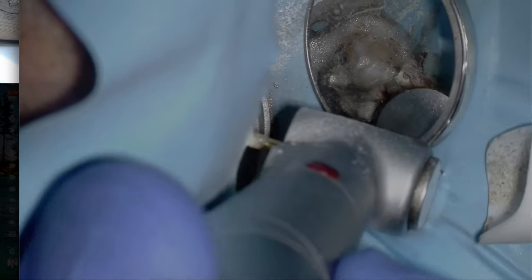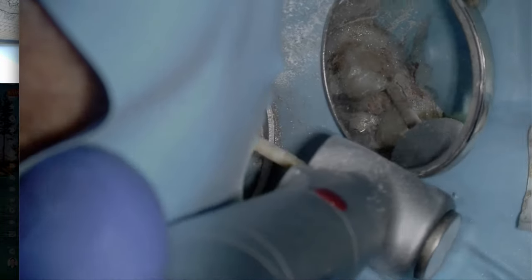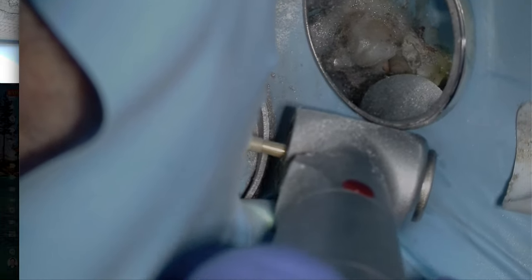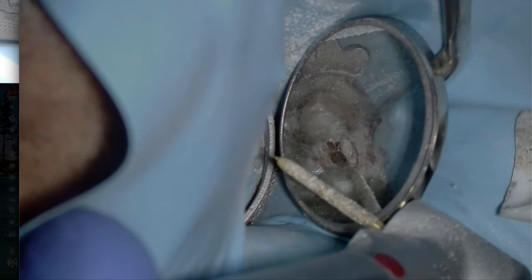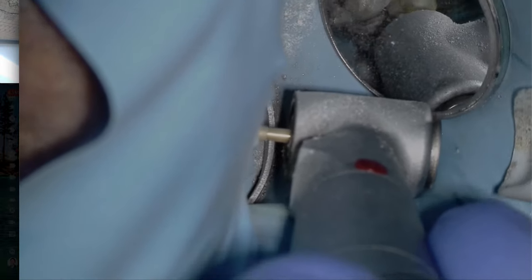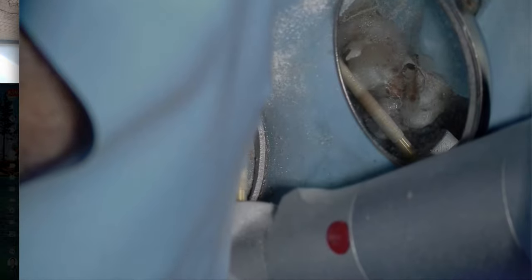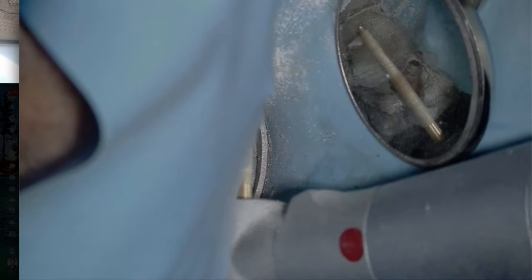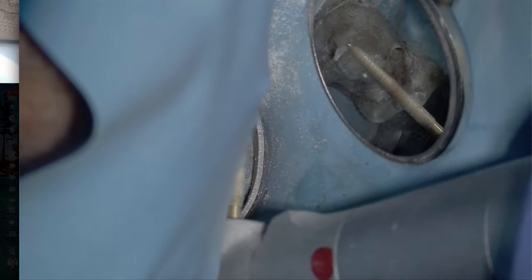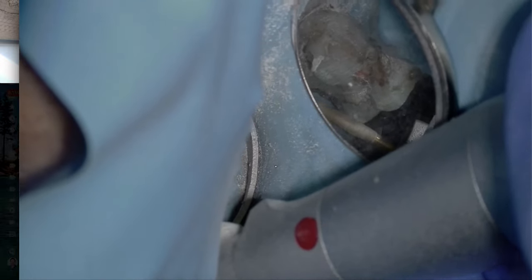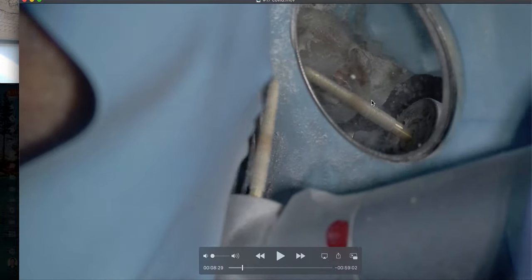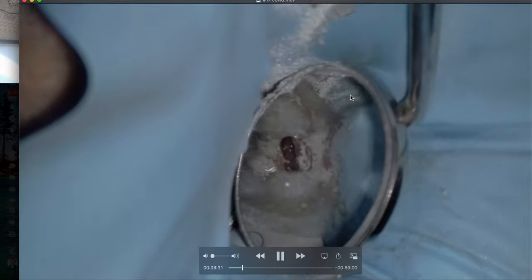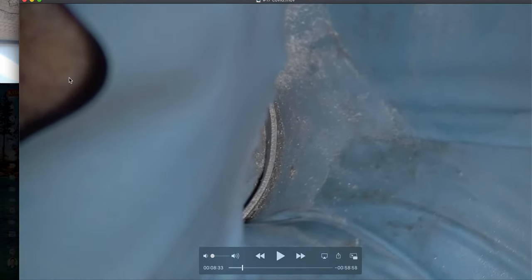And this is still at 40,000 RPM. And then we're going to do is I want to show you just reducing the cusps with a slow speed diamond. Now, it's going to chew out. You're going to have to clean out the diamond somehow at another, maybe when you do your pre-disinfection because you can't wash it here. But what we're doing here is this is just a 40,000 RPM reducing the cusps. So it is doable with a diamond burr. Likely, I'm not sure if it's going to reduce the life of the diamond burr. Probably it will, hard to say, but it does work. And the reason why I'm reducing the cusps here is just to get a stable reference point. And when the patient is done, it's a little bit out of the patient's bite.